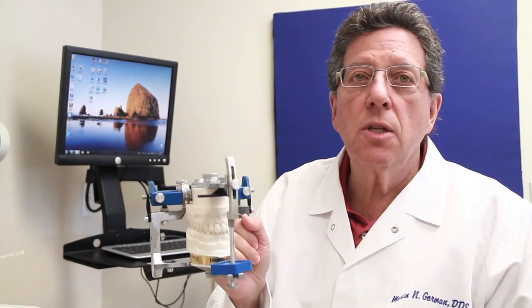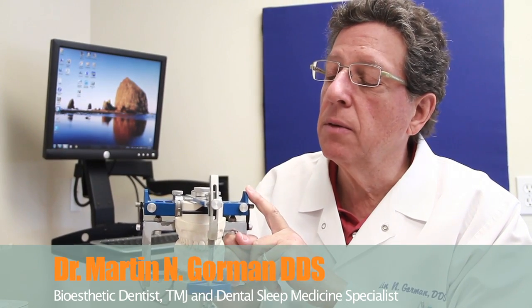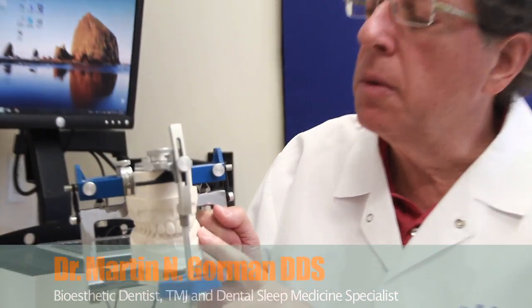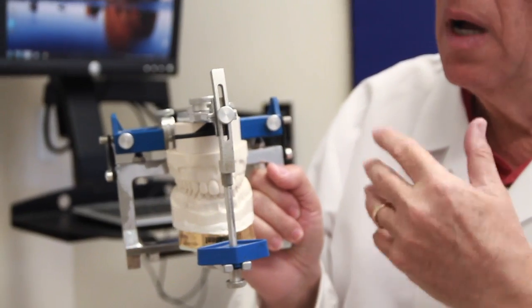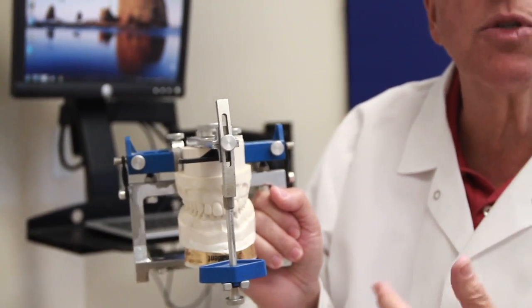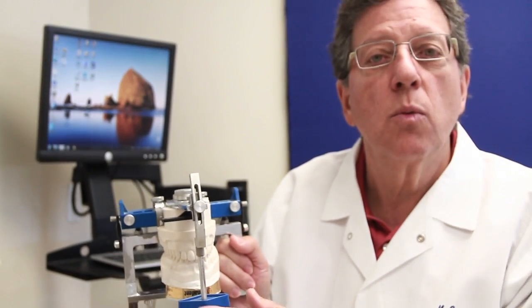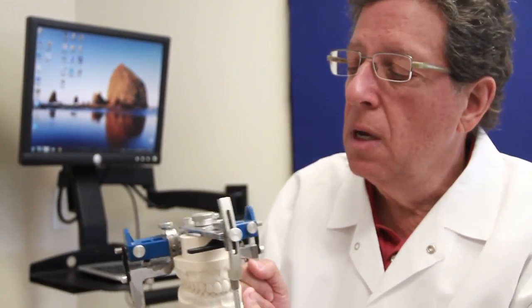Hi. This is the bio-aesthetic model mounted on an old original Panadent articulator. What I'm going to do is quickly review how the model works and why, when you do a bio-aesthetic rejuvenation on a patient, it works so well and is so long-lasting.